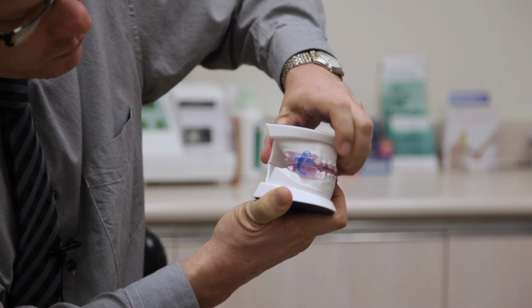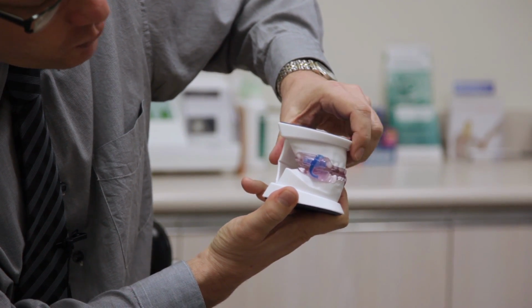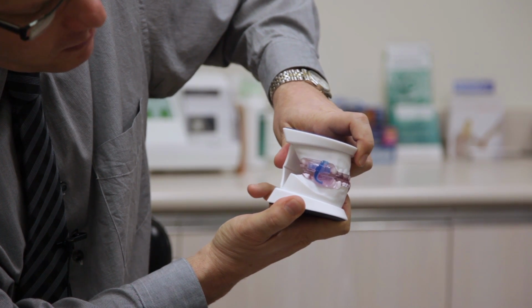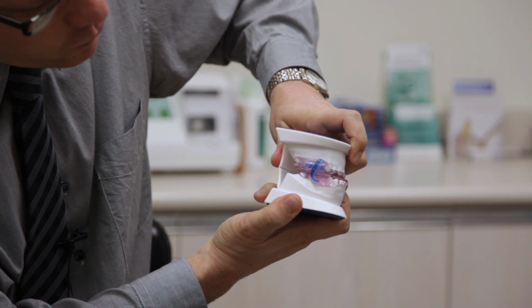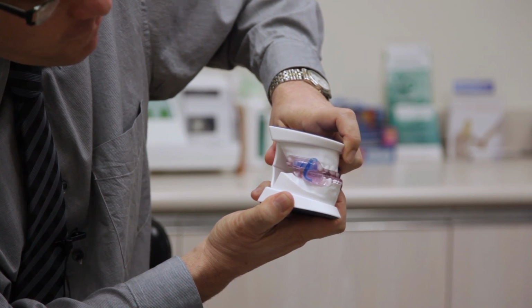So what we generally do is we begin in a position where we only move the jaw a little bit forward, and then we have a technique where we can gradually move the jaw forward until the patient gets to a position where they can go as far forward as possible without causing damage to the joint. If we find that we've gone too far forward, we always have the option of moving them backwards. So this is not guesswork, this is very precise, exact work, and we get a great result.